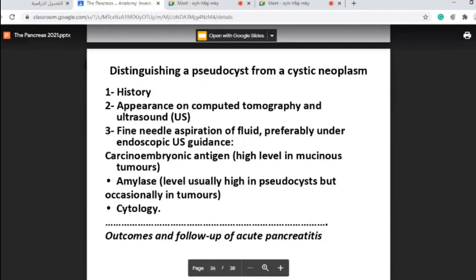As we mentioned, we have endoscopic ultrasound. The gastroscope contains a probe for ultrasound and another probe for FNA. Once we pass this endoscope through the mouth, to the esophagus, stomach and the duodenum, we have a probe of ultrasound, what we call endoscopic ultrasound. And also we can pass a needle and do aspiration of this cyst and study the cells, maybe malignant cells.